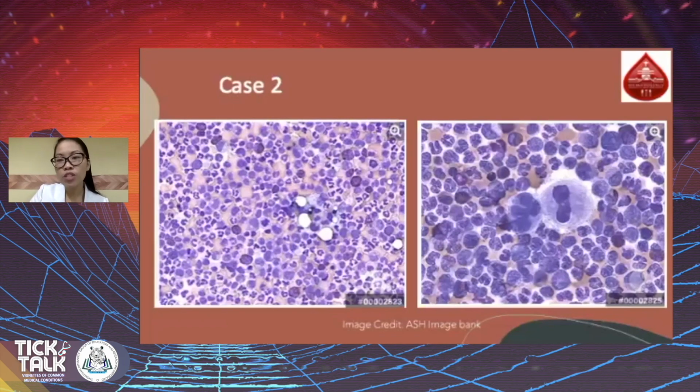Additional workup for this elderly male's leukocytosis included a bone marrow aspiration and core biopsy, revealing a markedly hypercellular marrow. Remember, this is a 70-year-old male. Granulocytic hyperplasia with progression, showing all stages of maturation, and relative erythroid hypoplasia with small hypolobated megakaryocytes termed as dwarf megs. So it's as if there are small megs in a sea of granulocytes.